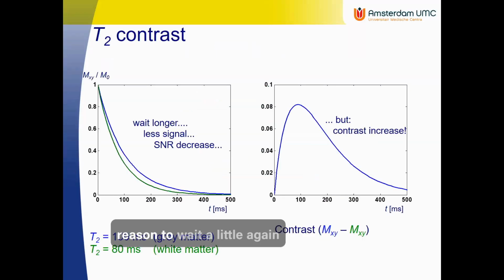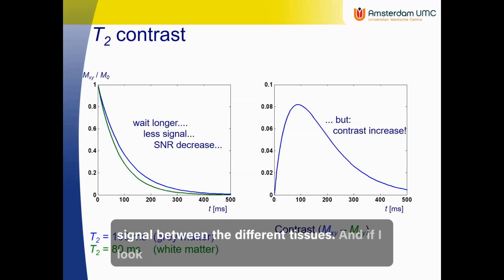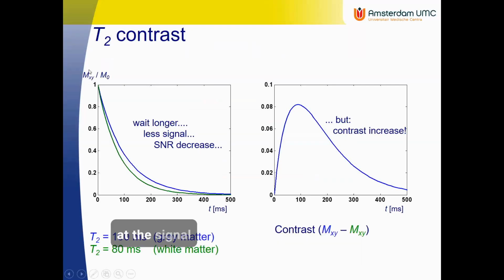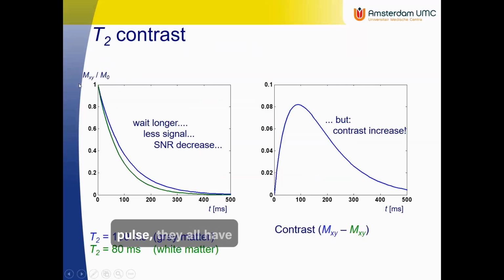The reason to wait a little again is contrast. I would like to see differences in signal between the different tissues. If I look at the signal of the different tissues right after the excitation pulse, they all have a maximum signal, and there is no signal difference.